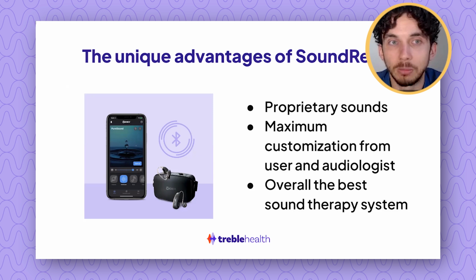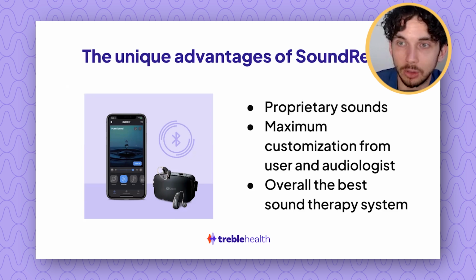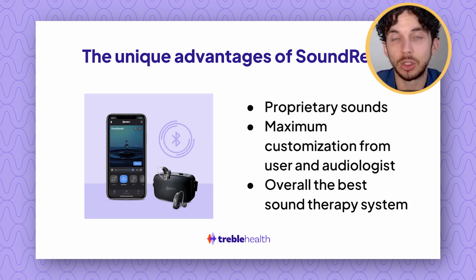We know that sound therapy treatment works, and it should be used in unison with stress reduction, a holistic view on the psychology, the negative mental reactions. So using some CBT, some cognitive behavioral therapy techniques with some stress reduction, maybe some mindfulness, maybe some meditation, maybe a holistic view on well-being, and having these devices in the ears with sound therapy treatment. Plus, we can adjust these specific devices so that they can work for someone who has some hearing loss. That makes them tinnitus maskers plus hearing aids. We take that whole comprehensive viewpoint, and that leads to the best outcomes for our patients. Hands down, we see that every day.